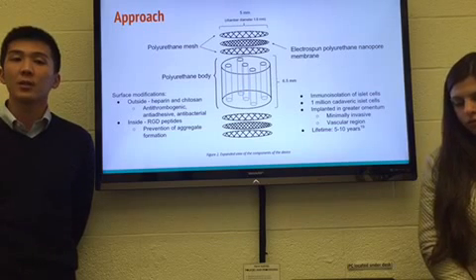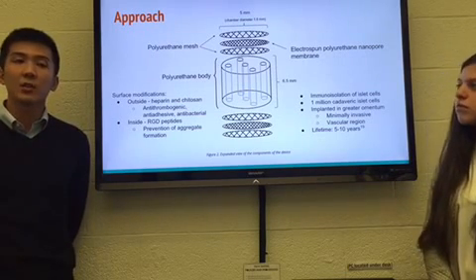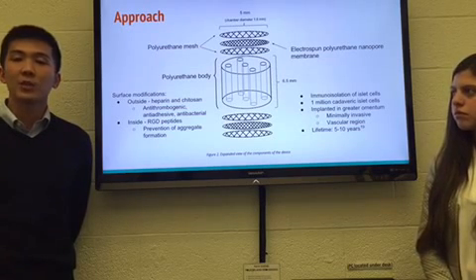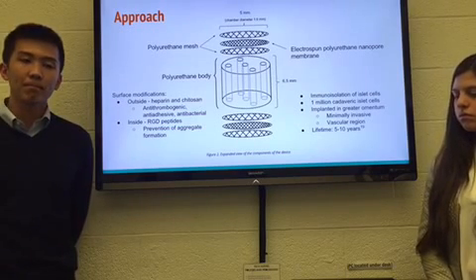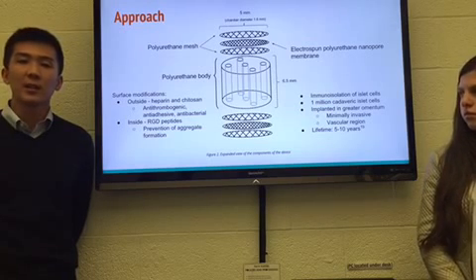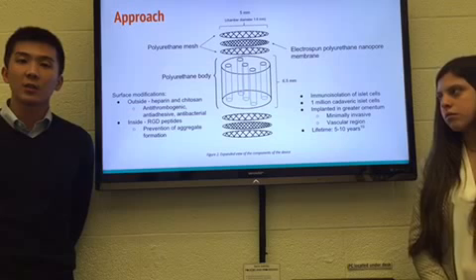The inside will be coated with RGD peptides, which will allow islet cell adhesion, and this will be done in a manner so as not to allow formation of islet cell aggregates, which can negatively affect the efficacy of these islet cells. What this device does is it immunoisolates the islet cells and allows them to perform their natural function without inducing an autoimmune response.